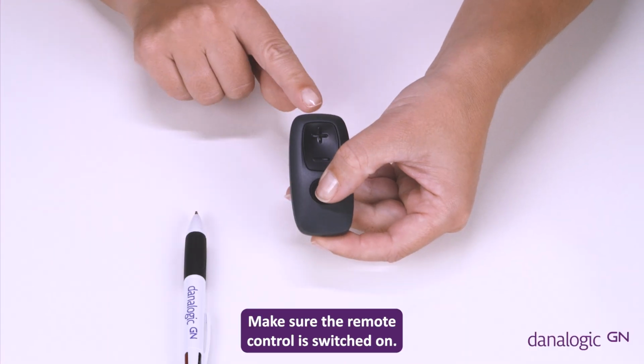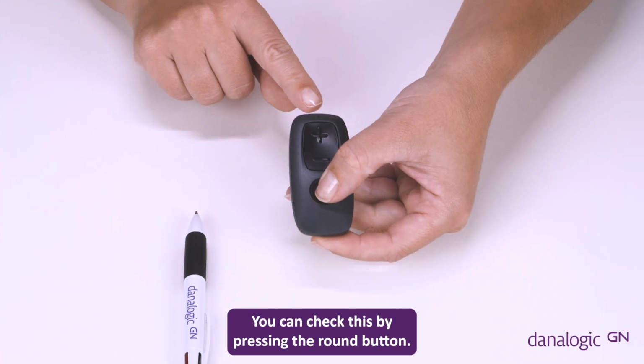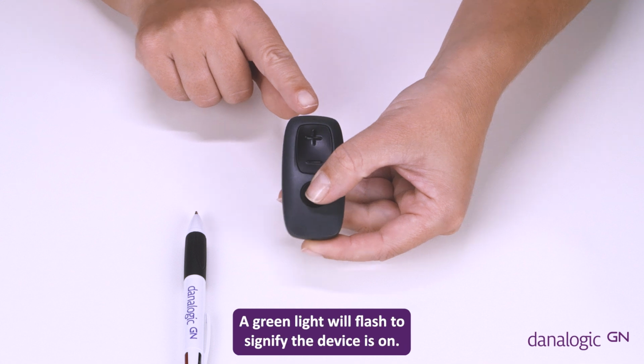Make sure the remote control is switched on. You can check this by pressing the round button. A green light will flash to signify the device is on.